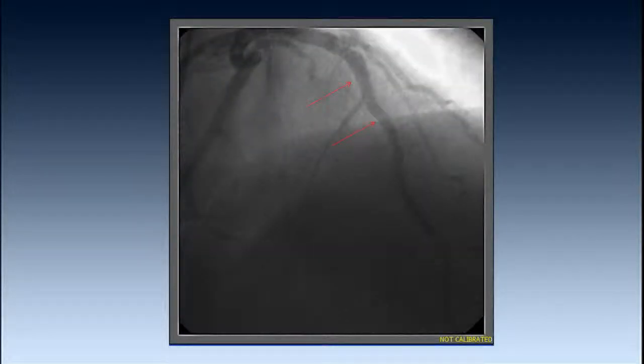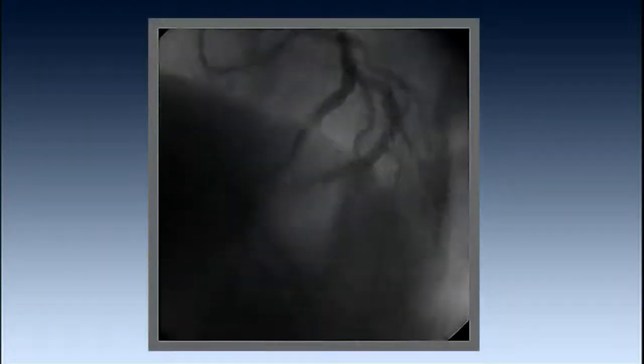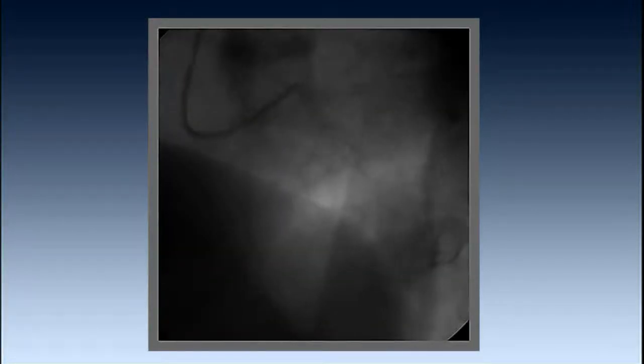For some of you who sometimes question us about side branch patency, I think this is a good example. Despite the big thrombus burden that was there, after MGuard implantation the side branch, this septal, is preserved and still open. Perhaps to better appreciate in a different view, you see that the vessel is open, and we have a very acceptable result.